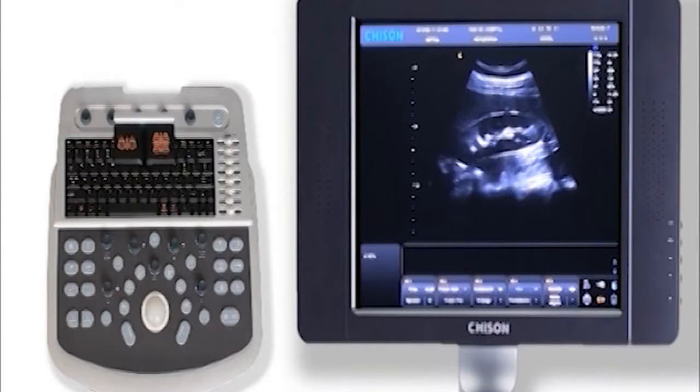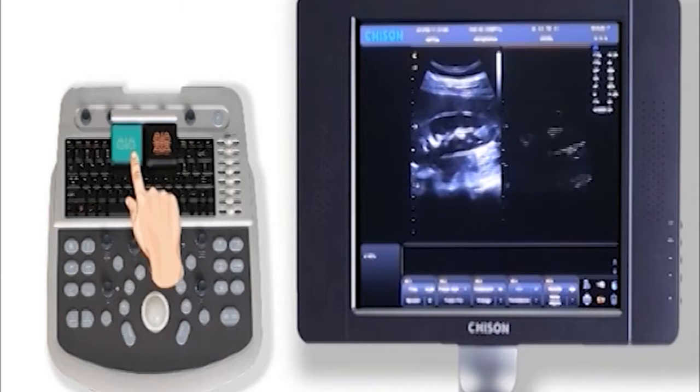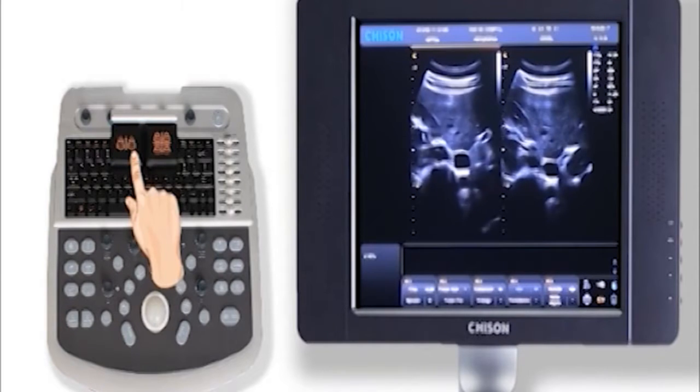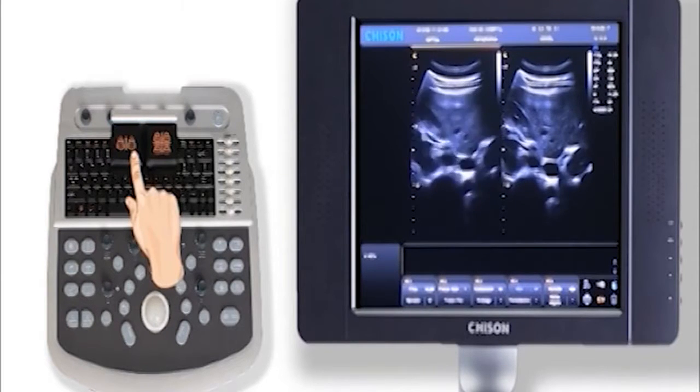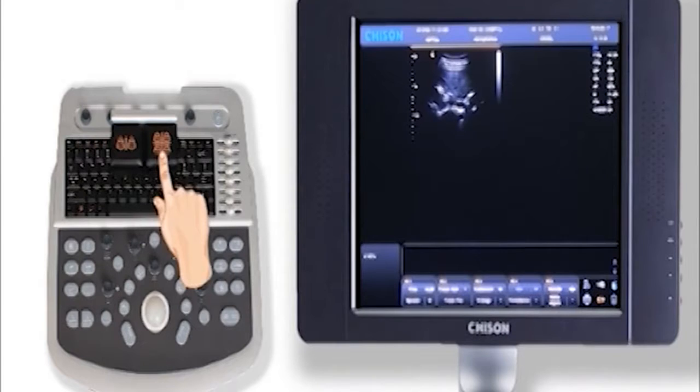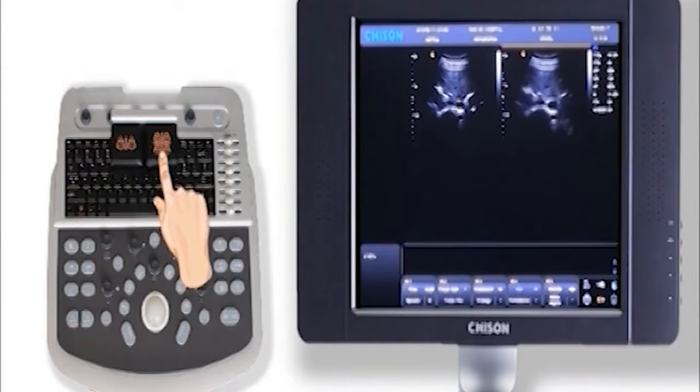If you need 2B mode, press this key twice. And if you need 4B mode, just press this key four times.